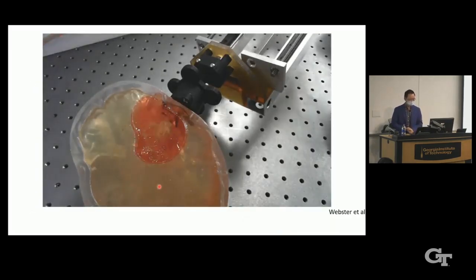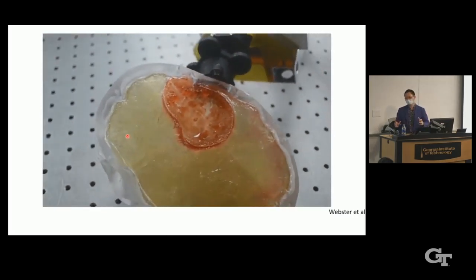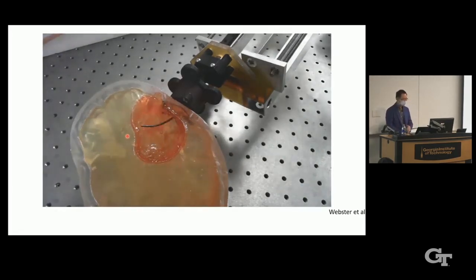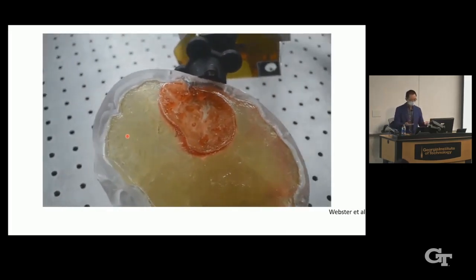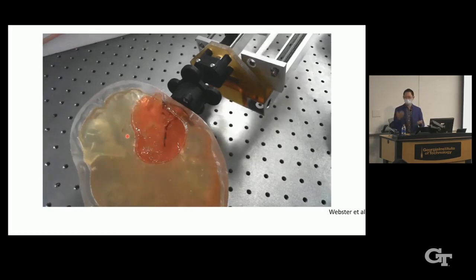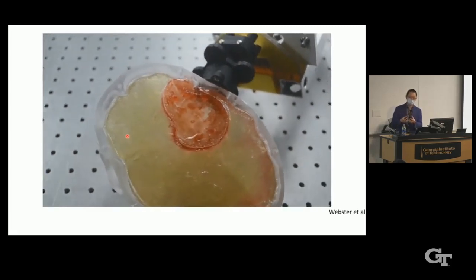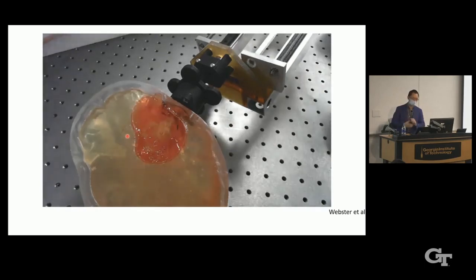And as you can see, we use this red gelatin to represent the blood clot, and we use this transparent gelatin to represent the normal healthy tissue. So we can say we take all the blood clot out. But from this video, we found out we need to have image feedback, right? Because in the benchtop test, we cut the brain model in half. But in the real experiment, we want to see how much we have already evacuated. Where is the inner tube with respect to the boundary of the blood clot?